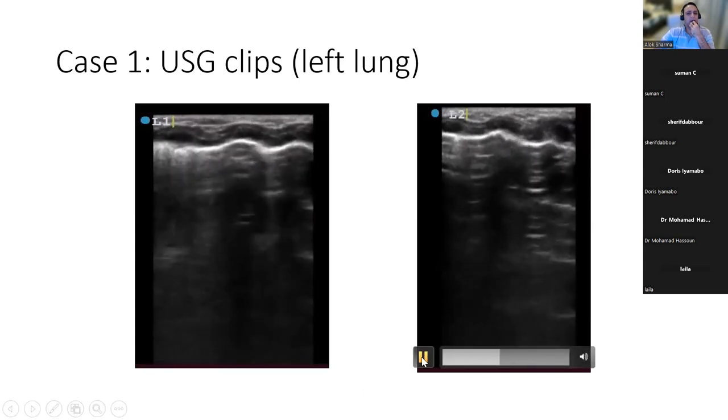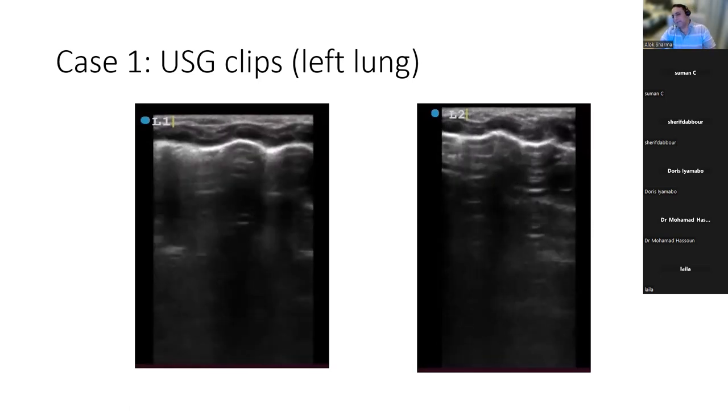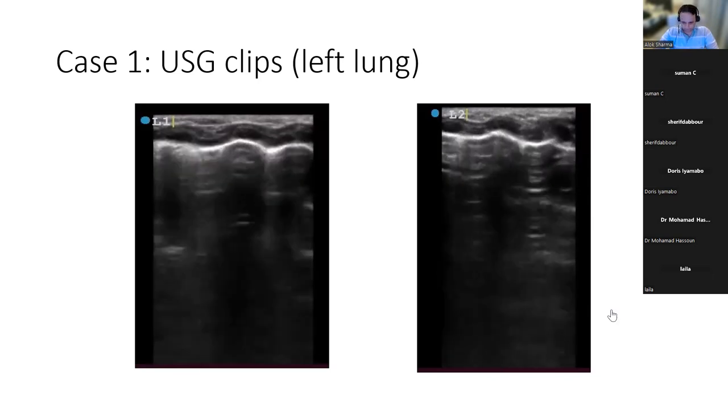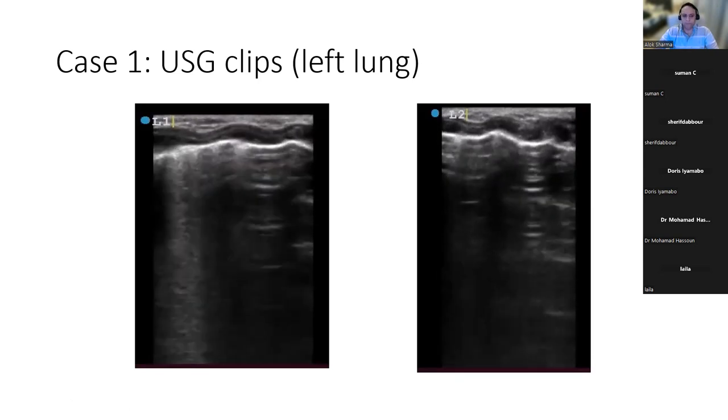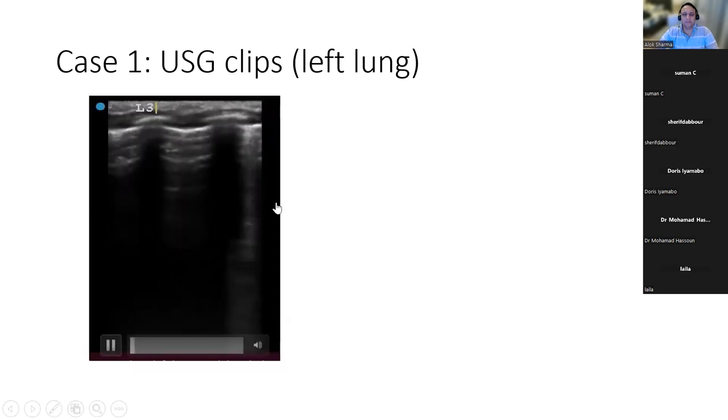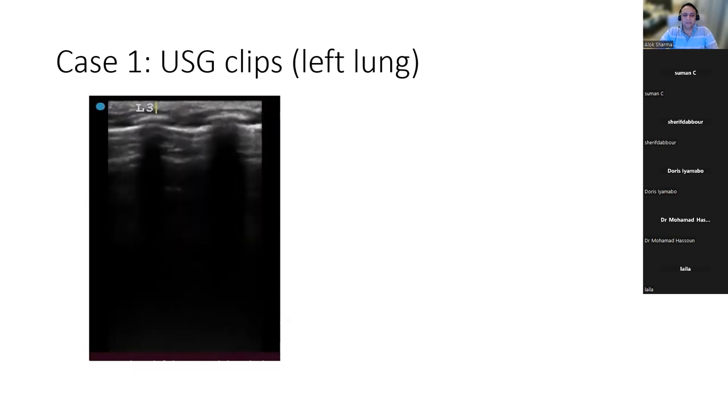Moving on. In L2, it is even more clear. The pleura is sliding, sharp, and mostly A lines. These are A profile. The L1, I would also take as A profile. I agree completely. L3 again. Here, towards the upper parts, again, a lot of A lines. Though I think I have missed, or there is some probe orientation issue, so that the lower side is a little darker. What frequency are you using at L3, please? This is 9.5. Do you need to drop the frequency a little bit to 8? It's because this baby is probably about 1.7, 1.8 kilograms now?